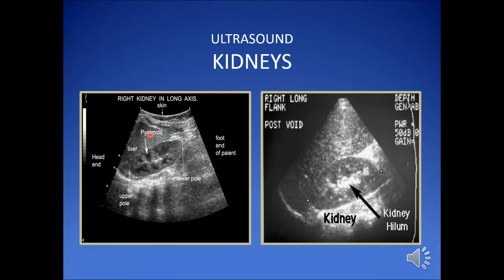So again, see here the longitudinal slice of the kidney. So this is the right kidney. So these are the renal pyramids. It is hypo or anechoic. This is the central renal sinus, superior pole and the inferior pole. So this is the echogenic central renal sinus.